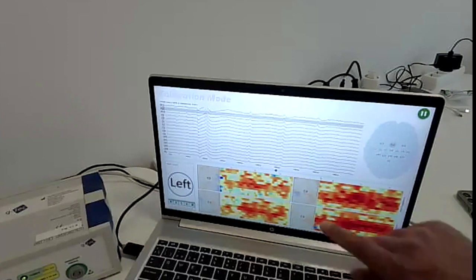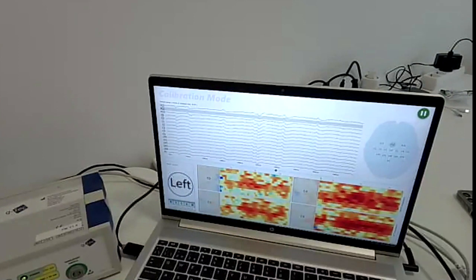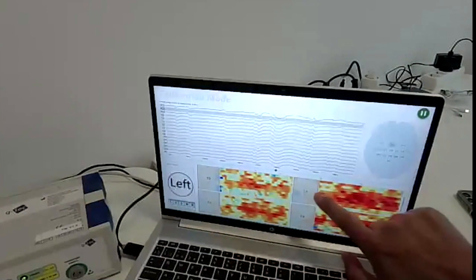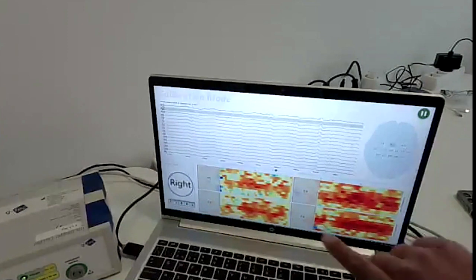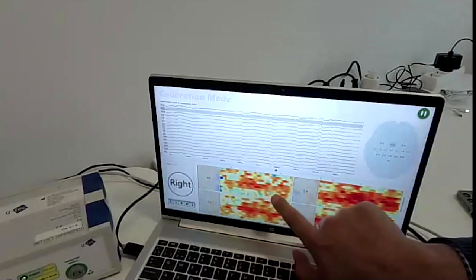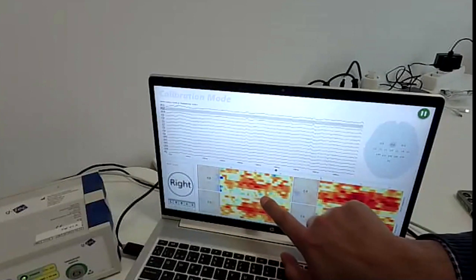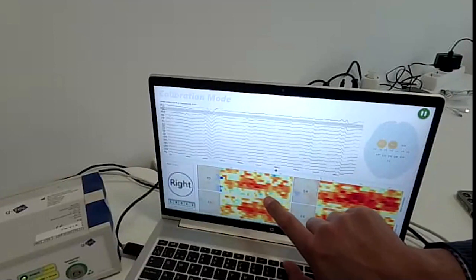So what we expect to see here, as I said before, these plots should be treated in horizontal. So we have here the C3 activity and the C4 activity. What we expect, if the patient is concentrated on the session and he's doing this motor imagination, is cold colors during the motor imagination, so blue, green, light blue colors on the hemisphere that is actually doing the movement.